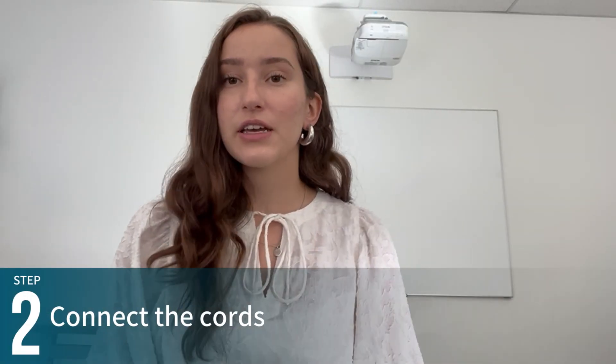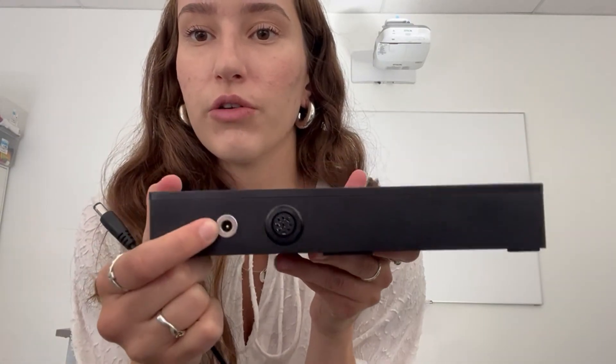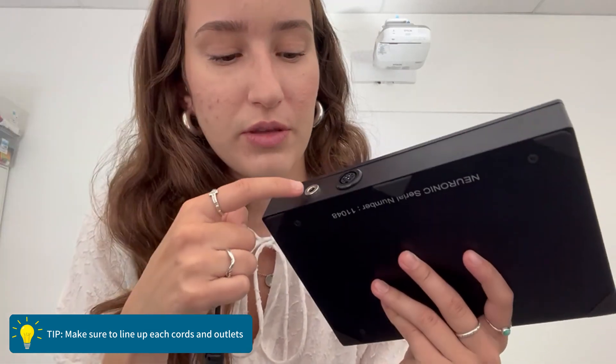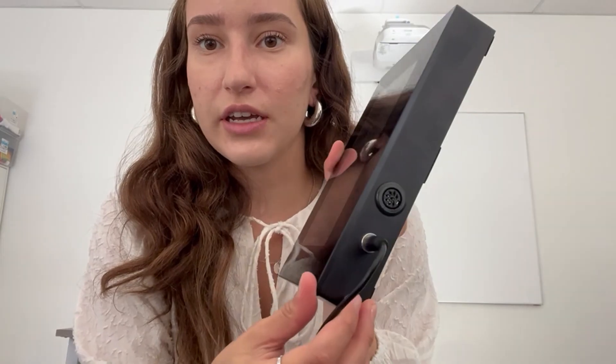Once you've ensured that you have all your components, we can start setting up the device. Take the black cord with the wall outlet end and plug one end into the power bar — it should fit just like that, nice and snug. The other end of the power bar has a little cord which will be plugged into your controller in the smaller hole here. Make sure you line up the hole with the pin, otherwise you might run into some issues, so just plug it in and make sure it's snug.